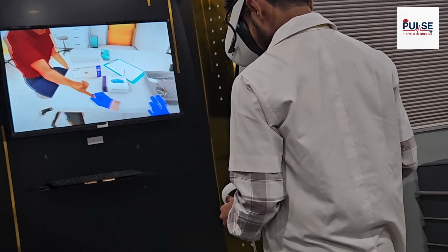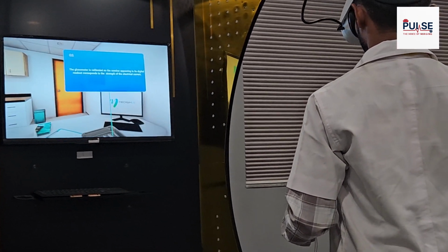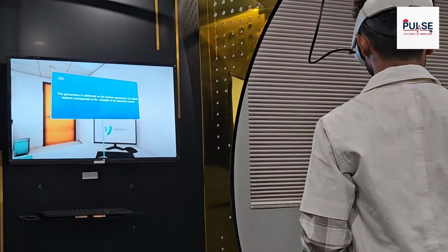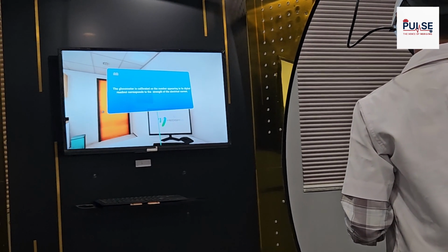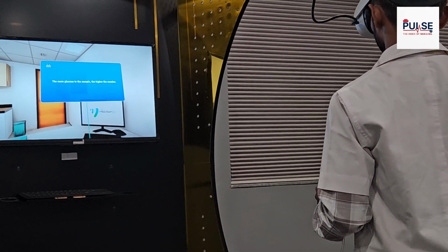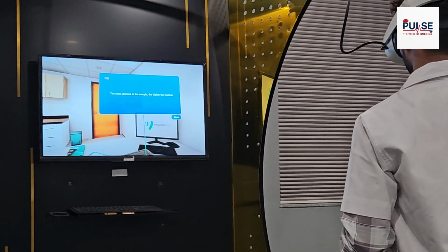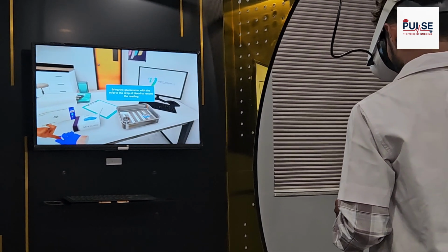Now we are going to learn about glucometer calibration. The glucometer is calibrated so the number appearing in its digital readout corresponds to the strength of the electrical current. The more glucose in the sample, the higher the number. Bring the glucometer with a strip to the drop of blood to record the reading.